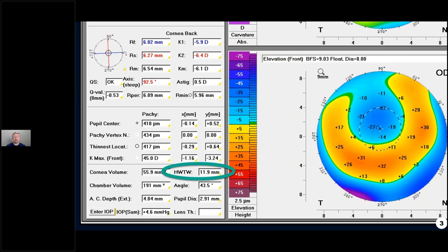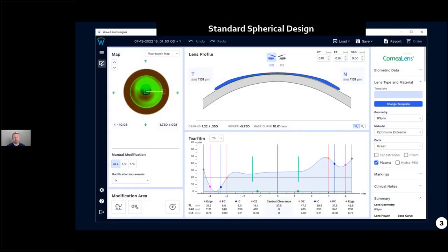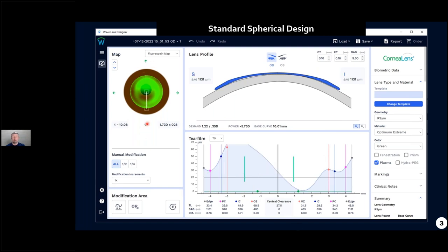Let's put a standard GP lens on his eye using WAVE. This rotationally symmetrical spherical 9-millimeter diameter lens is sitting way up off the cornea — it's going to vault the cornea tremendously. The fluorescein simulation shows lots of pooling centrally and hard bearing in the periphery. In the vertical meridian, we can see we're bearing down here and have lots of pooling of fluorescein centrally. This is a really poorly fit lens — it's going to move all over the place and probably pop out of his eye every time he blinks.